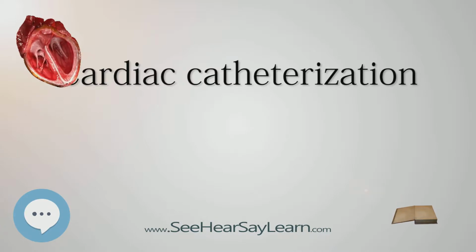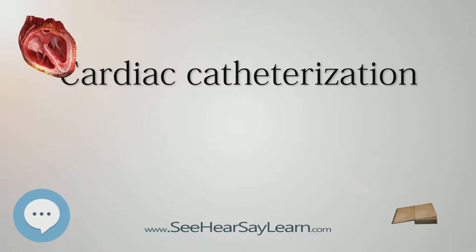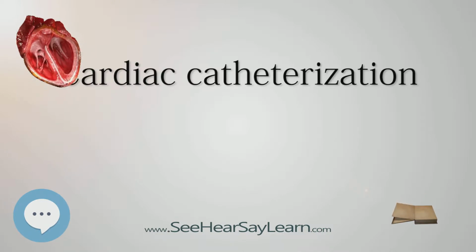Procedure. Cardiac catheterization is a general term for a group of procedures that are performed using this method, such as coronary angiography and left ventricle angiography. Once the catheter is in place, it can be used to perform a number of procedures including coronary angioplasty, balloon septostomy, electrophysiology study or catheter ablation. Procedures can be diagnostic or therapeutic.